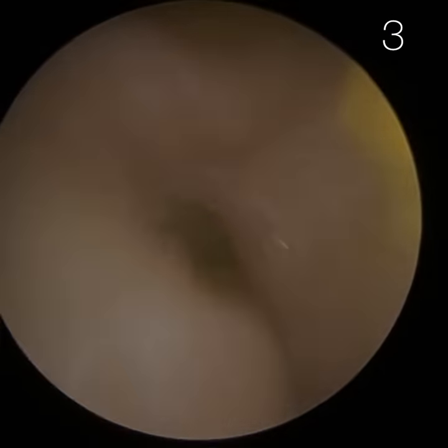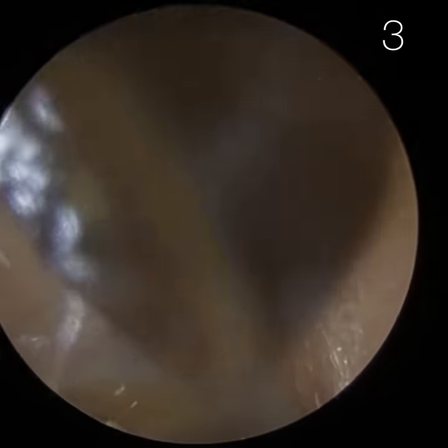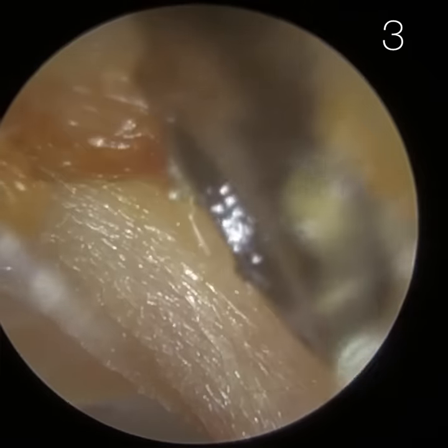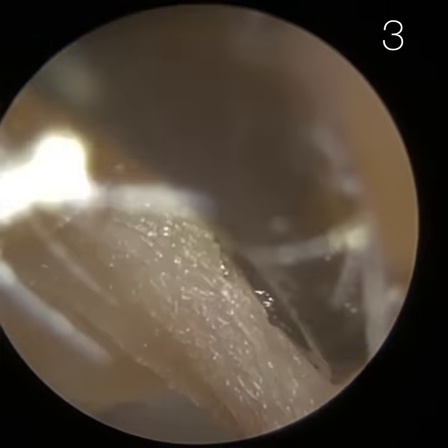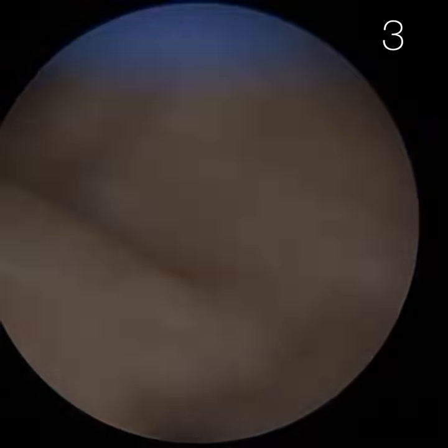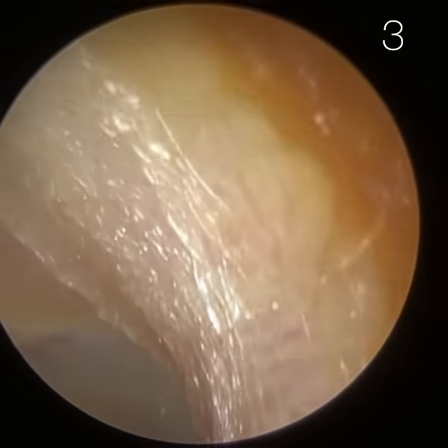This patient's got a really twisty, bendy ear, as you can see. The inner third — the skin's really dry, it's dying and cracking. This earwax was more lateral; it would appear it's not dissipating. Although the majority of earwax is produced on the outer third, it should spread and dissipate across the entire ear canal and eardrum to moisturise the whole ear. In this case, the inner third appears quite dry — that's a distinct border there. The wax I'm removing is on the outer third. I would definitely not be working on the bony part as it would be uncomfortable for the patient. It's not occluding the ear, so I'm removing as much as I can without causing any trauma.